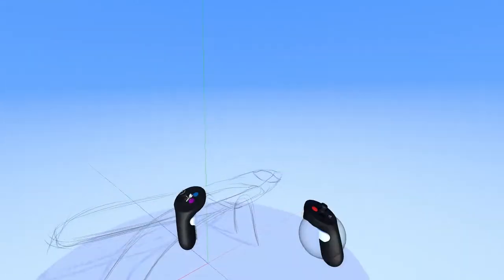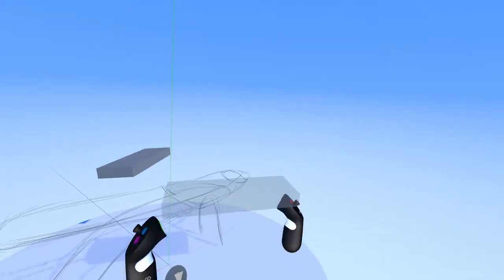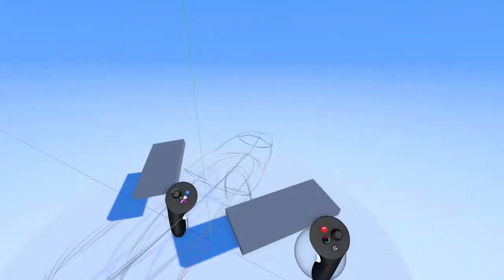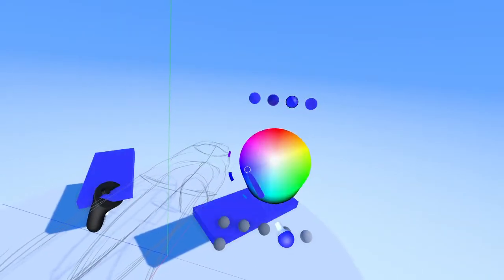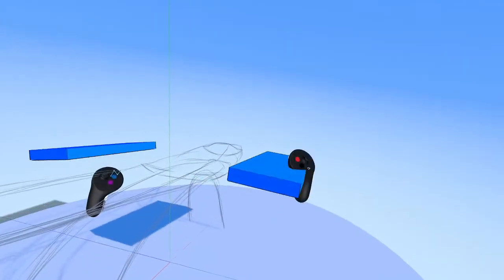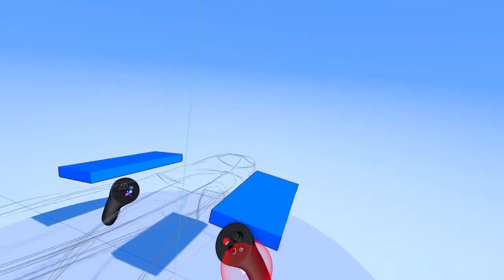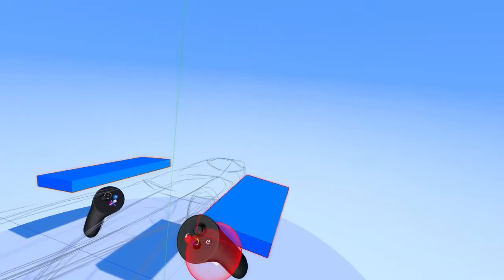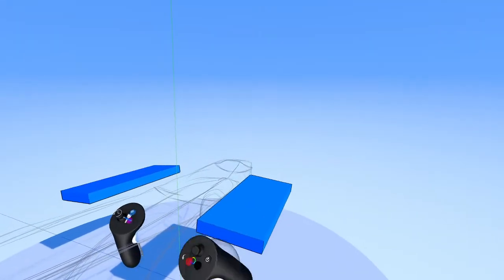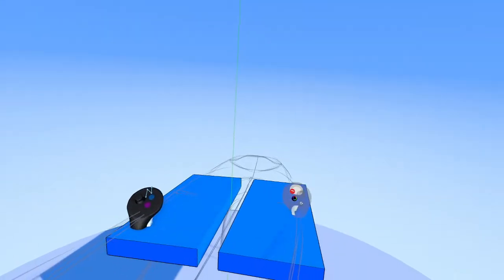I'm going to close this menu, press the pointer finger on the left-hand controller and the right-hand controller, and preview this shape. Now, we're not being super precise, so I'm just going to drop it in here. Anywhere will do. And let's change the color and the material. I like to work with toon material here because it just really boldens the outside or the outer line of the shape. Helps give me a better idea of what things are doing.